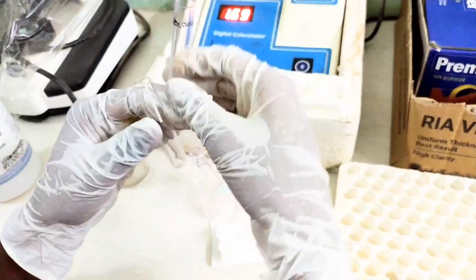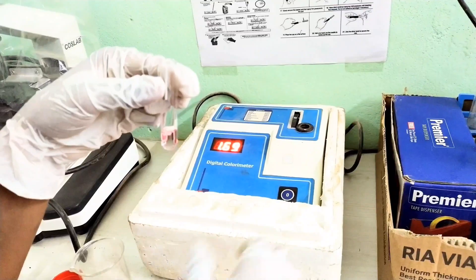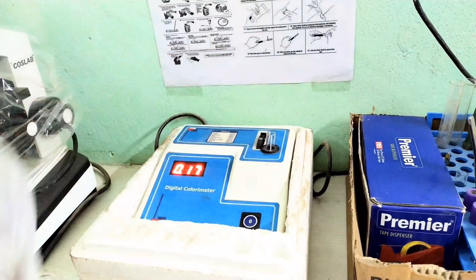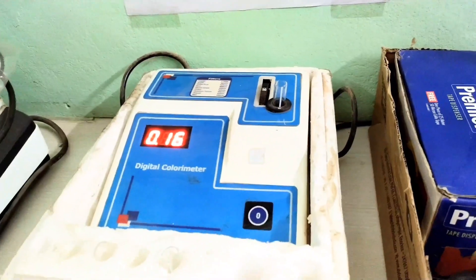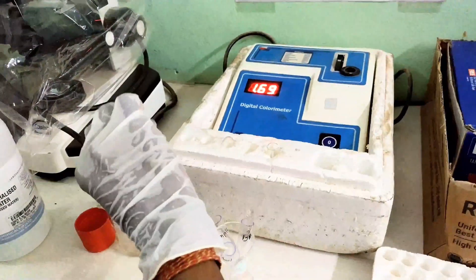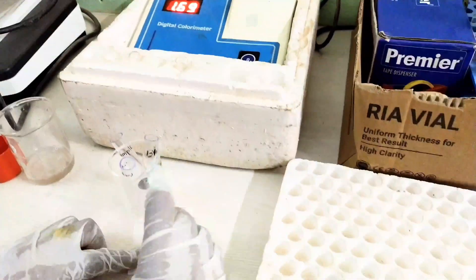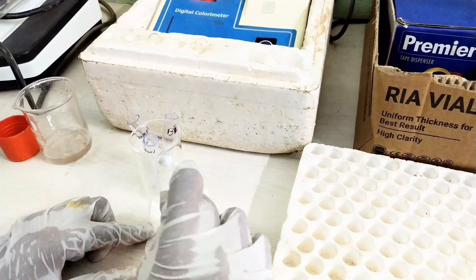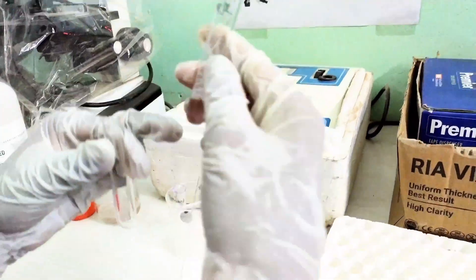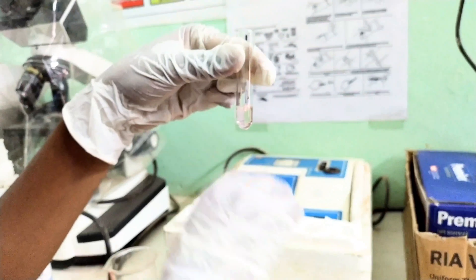Now read the standard sample. Clean the glass test tube well with distilled water and tap on tissue paper. After that, read the test sample.